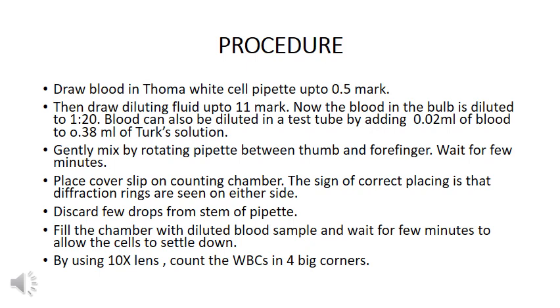After dilution with Turk solution, we will gently mix by rotating the pipette. Usually we avoid over mixing and rapid mixing, because of the chances of lysis of WBCs.